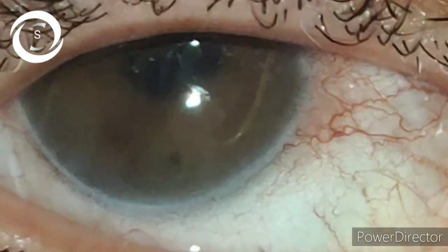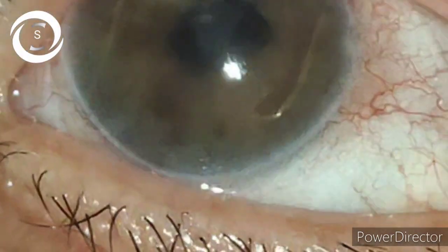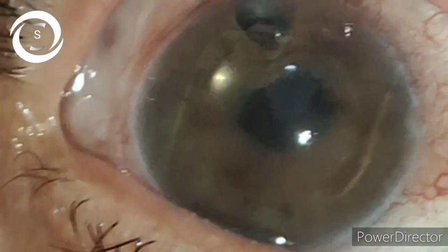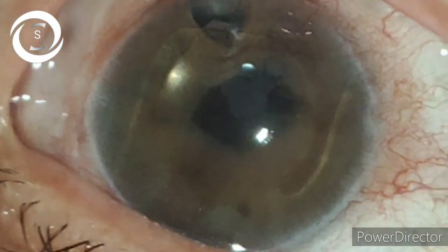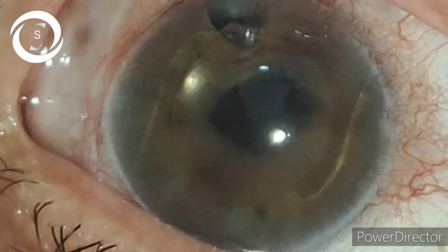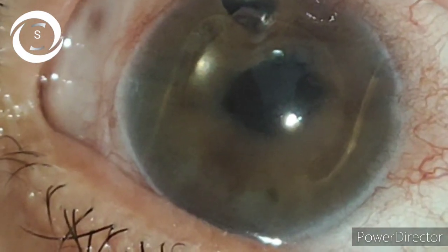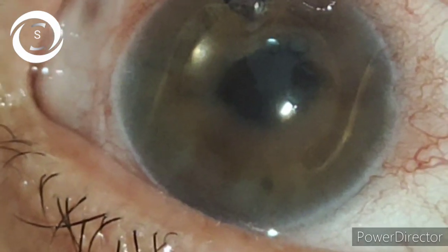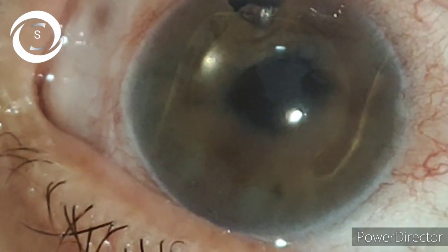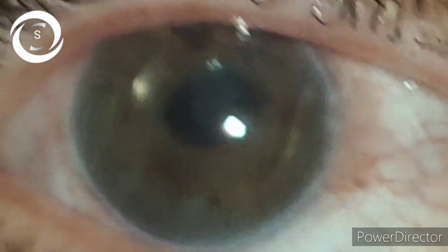AC IOLs are rarely used nowadays and should be avoided due to this complication. Scleral fixation, especially the sutureless Yamane technique, is recommended to avoid this dreadful complication. This was the third installment of the IOL series.